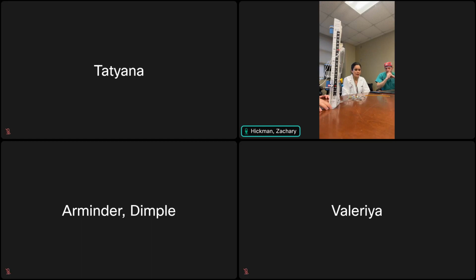And I would say if you want to do that, just do it very, very gentle. If you feel any resistance at all, don't keep going, because you can actually make it worse. If the whole tip is not inside the ventricle, these last holes, you can actually be suctioning brain and make the obstruction even worse, right? Yeah, and obviously one of the things that often clogs it is the choroid, and you don't want to suck more choroid in or cause it to bleed or whatnot.